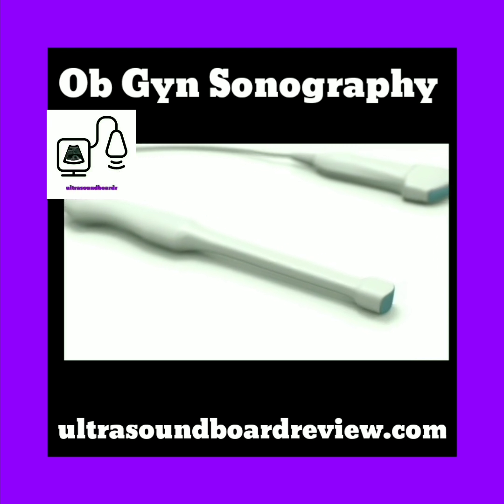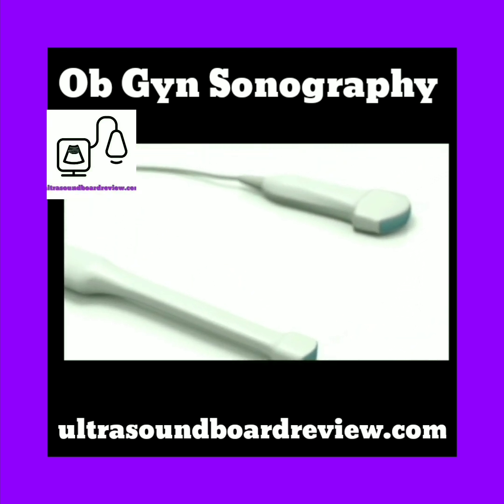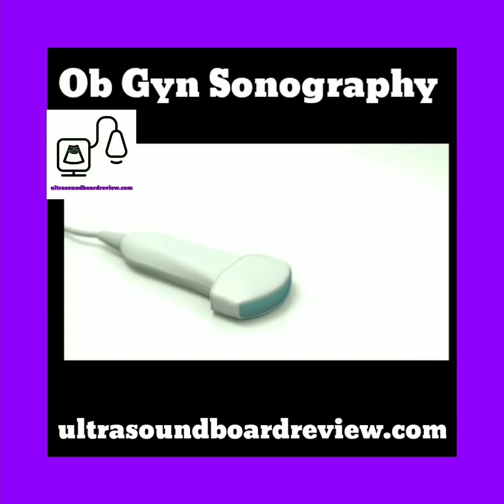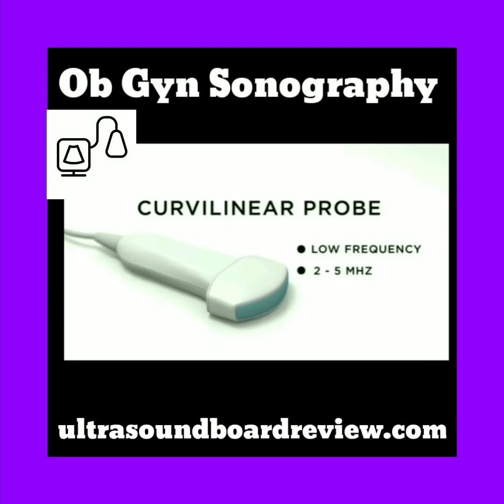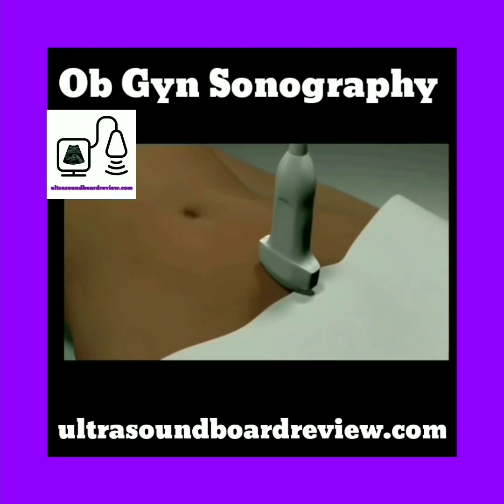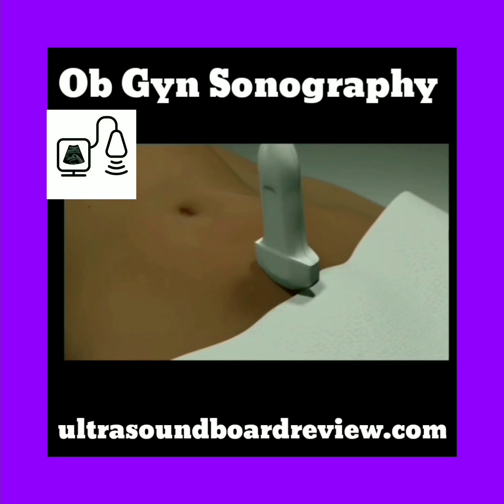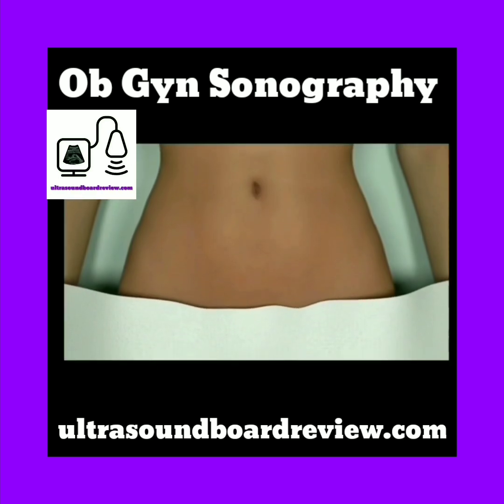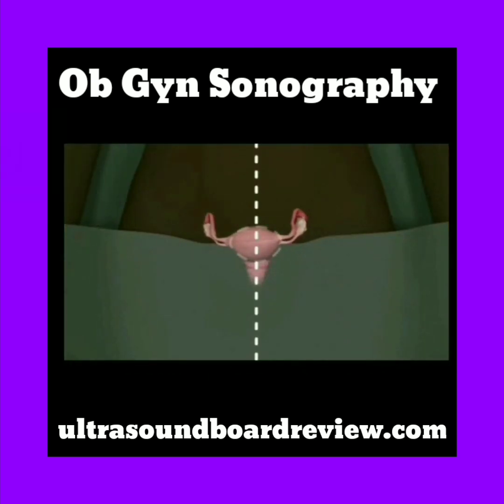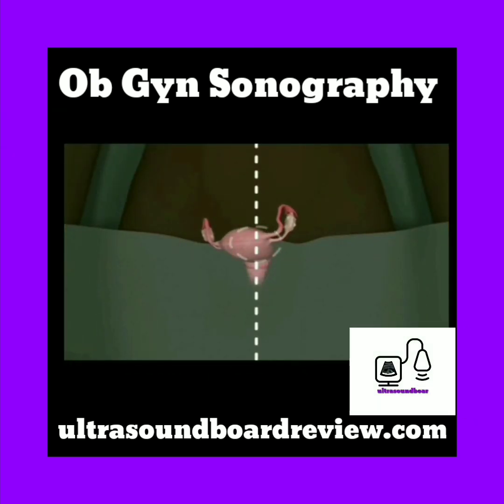The best approach to examine ovaries is with a transvaginal ultrasound probe, but for this exercise we will use a low-frequency curvilinear transducer. With the transducer marker pointing cephalad, obtain a mid-long axis view of the uterus. Keep in mind that the uterus may not lie exactly in the midline. It could be shifted toward the left or the right side.